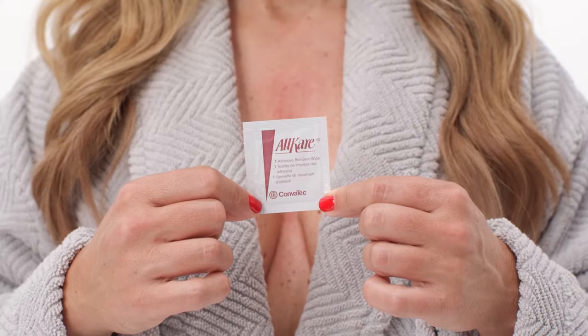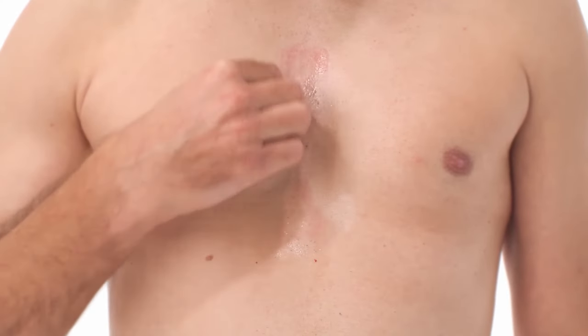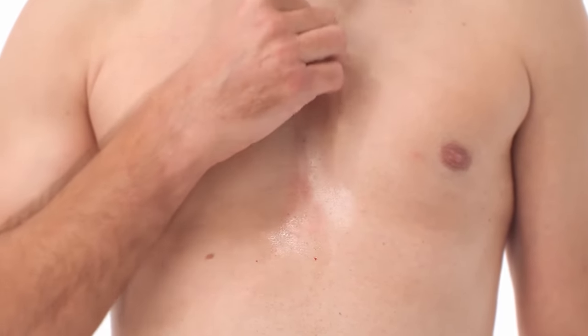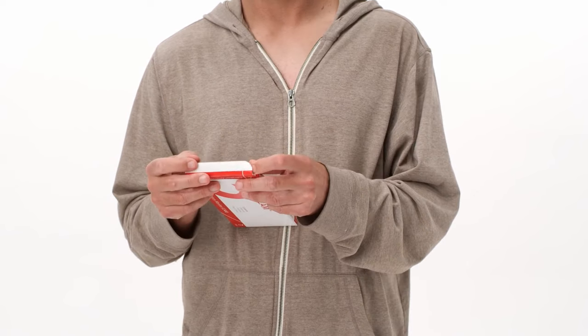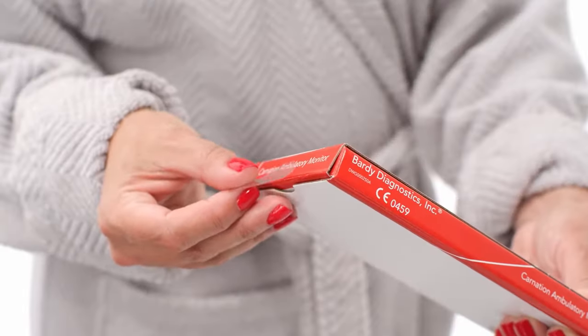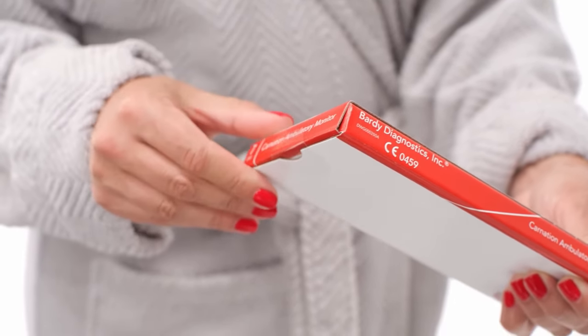Wipe off any remaining adhesive on the skin with the adhesive remover wipe pad provided in the box. Insert the CAM and the patient diary into the CAM box and seal it with the mailer sticker found in the patient diary. Lastly, instruct the patient to return the contents per the instructions of your hospital or clinic.